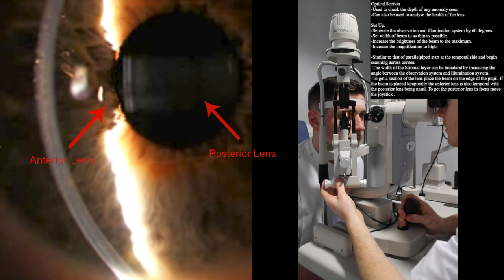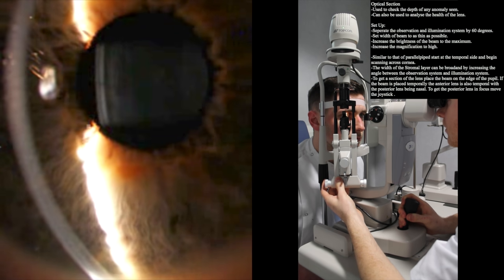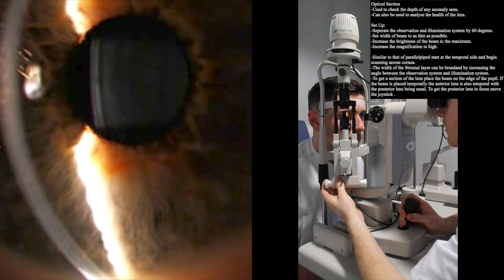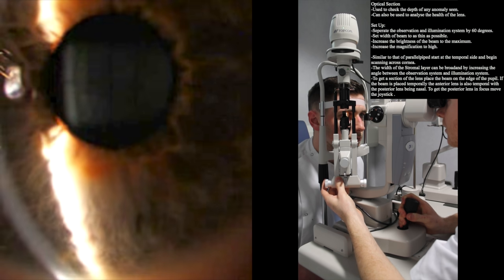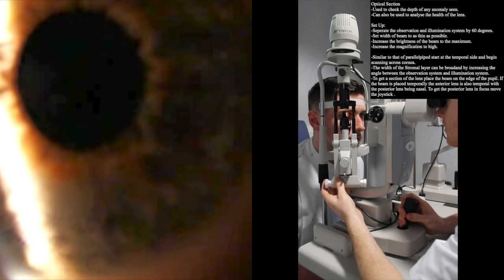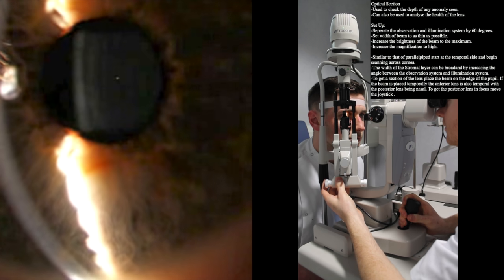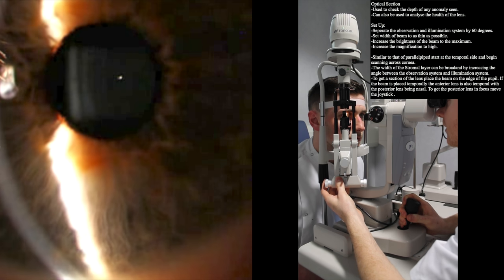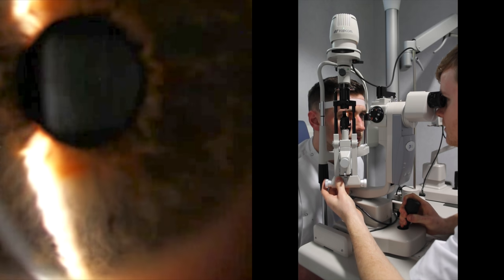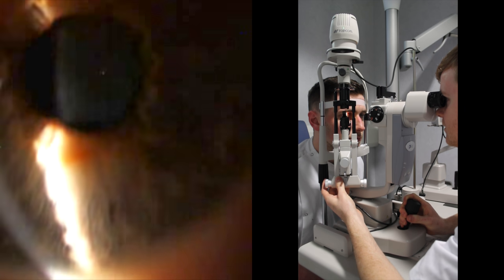To achieve a clear image of the posterior lens, move your joystick slightly until it is in focus. This method is particularly helpful in assessing and identifying cataracts.